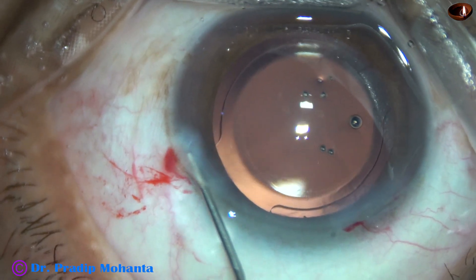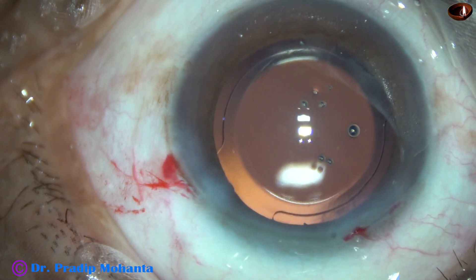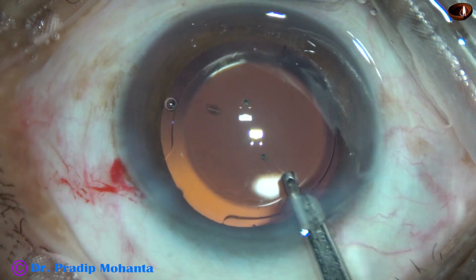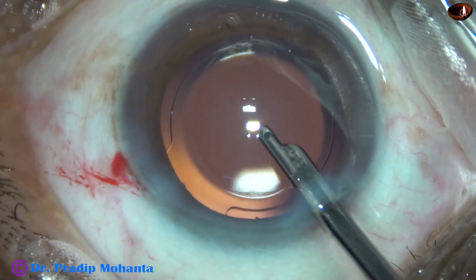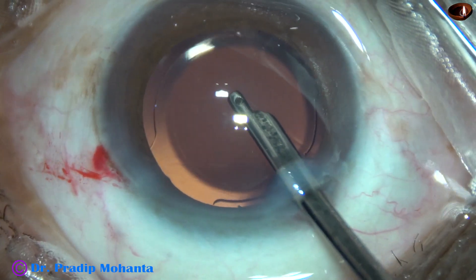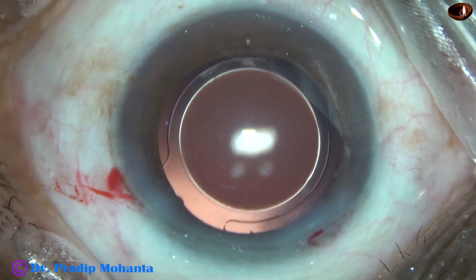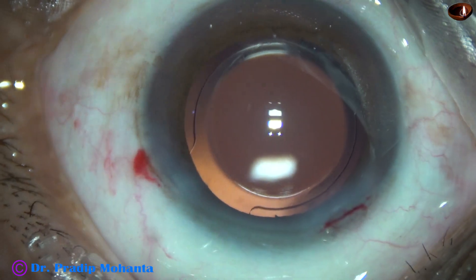This is closure of the side port by hydrating corneal stroma on either side of this stab wound. The main incision doesn't require any hydration. This is the final lavage of the anterior chamber. This final lavage helps in avoiding TASS — toxic anterior segment syndrome — and is done with BSS. The anterior chamber is formed very nicely, the integrity of the wounds are checked, there is no leakage from the wounds, and the case is concluded.